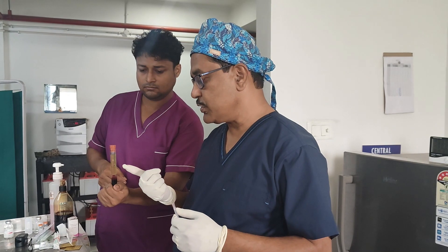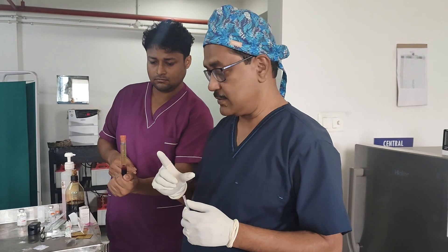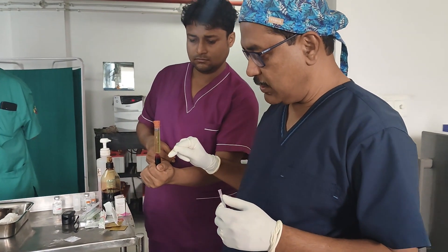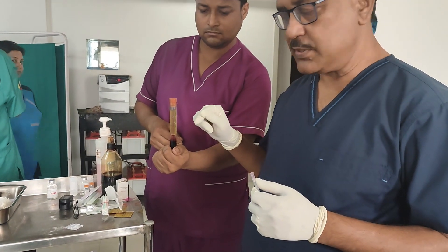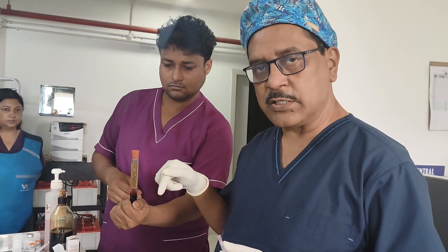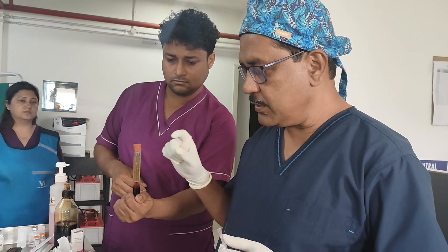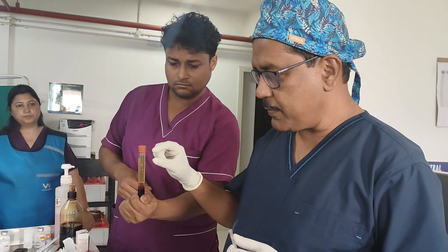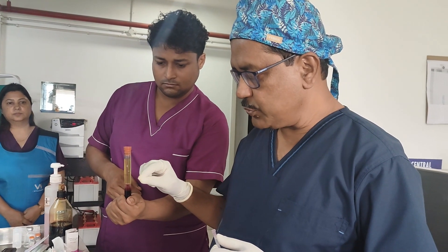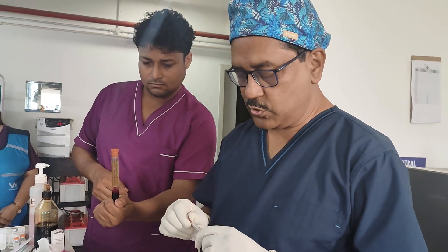Once centrifugation is done, the test tube shows different layers. The gel sits in the middle. Below the gel, the RBCs have accumulated — they are heavy and pass through the pores to the bottom. Above the gel we have the plasma: the upper part is platelet-poor plasma and the lower part, just above the gel, is the platelet-rich plasma.